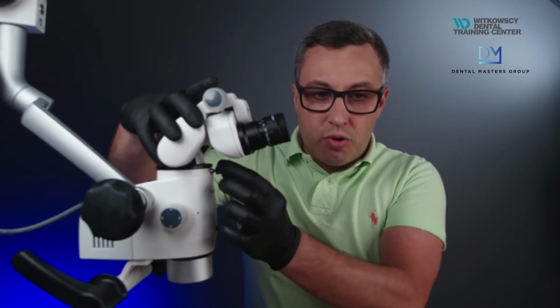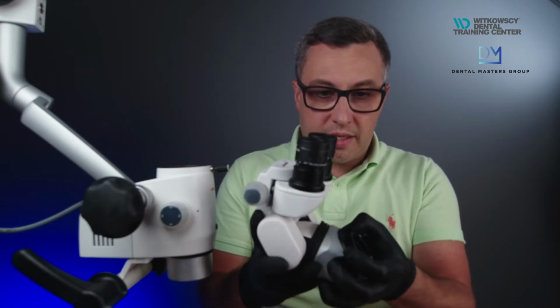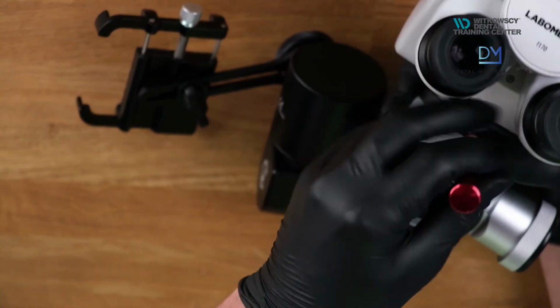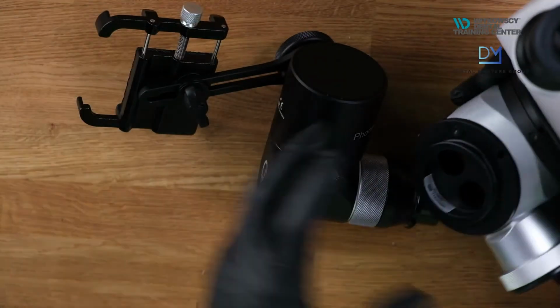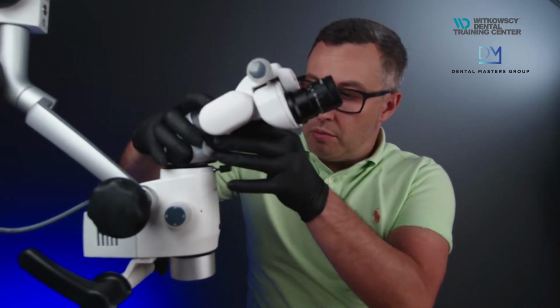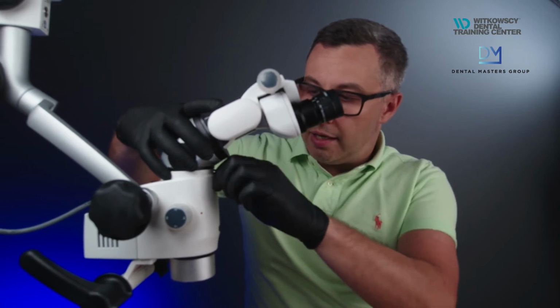First, you need to unscrew the binocular. Be careful, because it's optics. Then you put it directly like this, and you take the Allen screw. You take the Allen screw here, and you screw this device onto the binocular. Do it tightly, because this should be quite tight with no movement. Okay, when we have this, then you put it on the microscope. Be careful, because it can fall down. So you put it on, you position it, and you screw this screw in again.